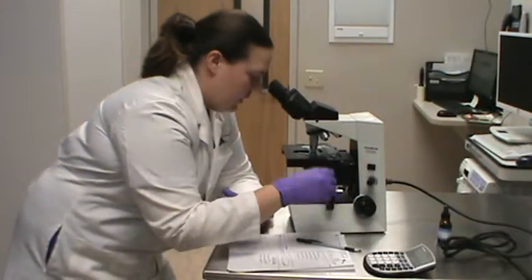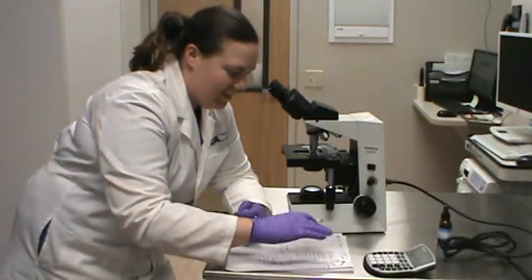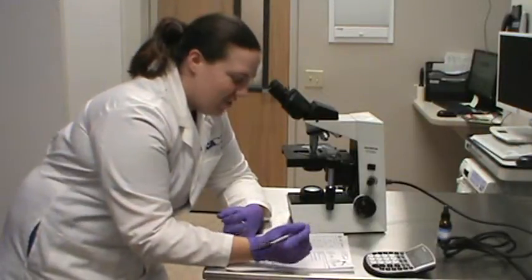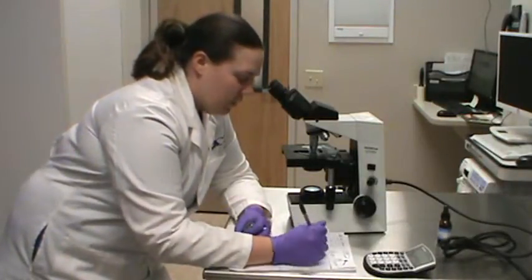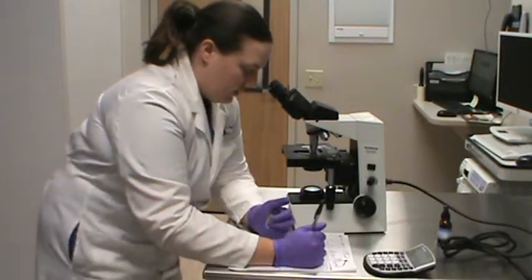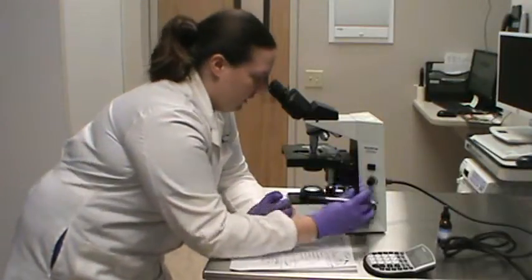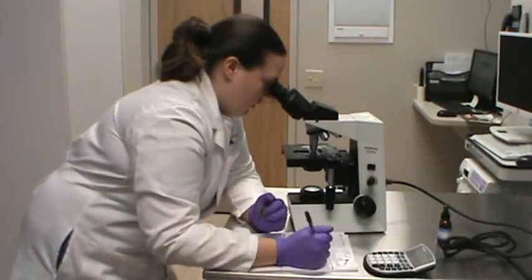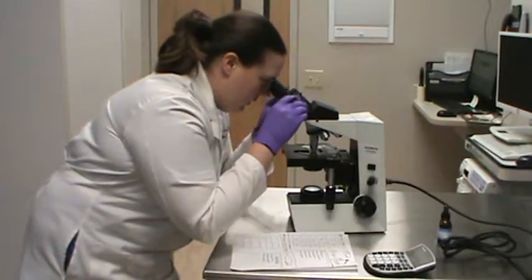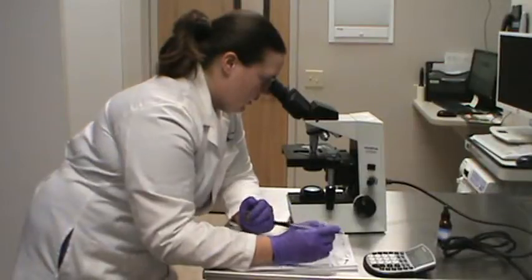Again, it's going to be a little more difficult just because I don't have a nice mechanical counter like in our textbook. Those are pretty awesome. So I need to manually keep in mind what I'm seeing and use this counter to help me count as well. Okay, so we're going to go ahead and count 100 white blood cells.